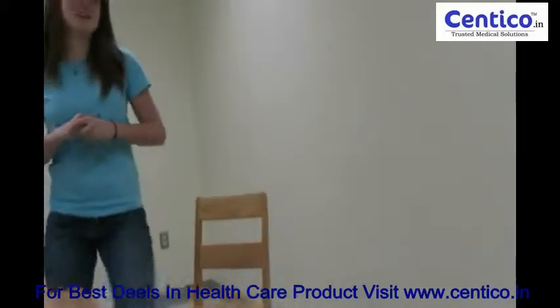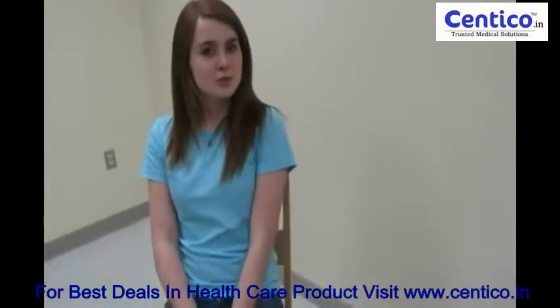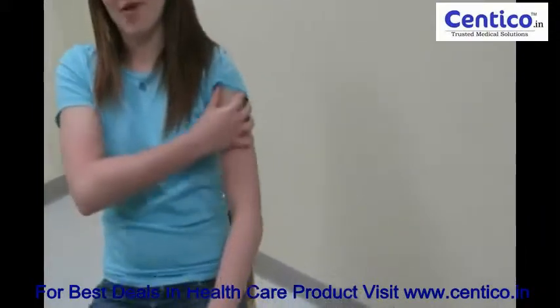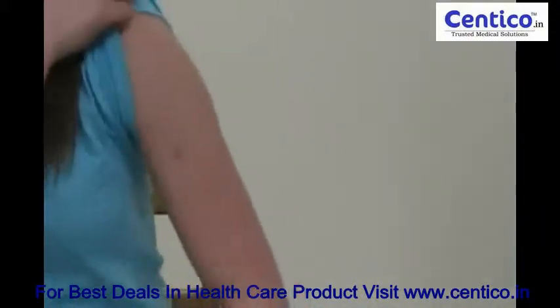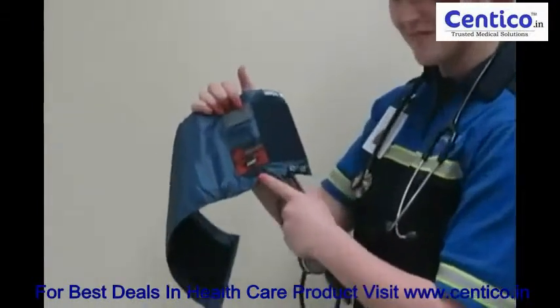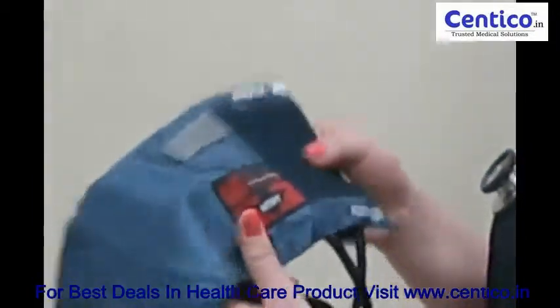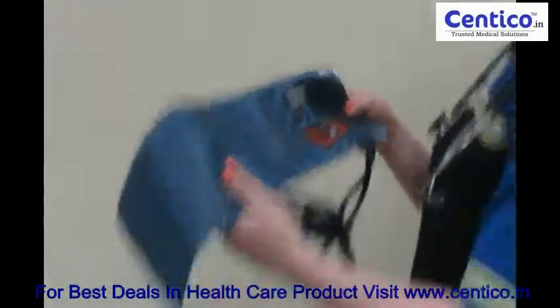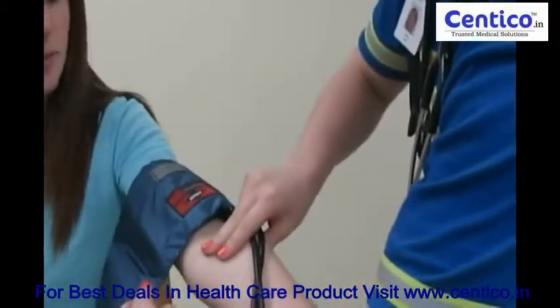First, I need to be sitting or lying down, comfortable and relaxed. For an optimal result, my arm should be free of all clothing, so my shirt needs to be removed or my sleeve pushed up. There is an arrow on the airbag of the sphygmomanometer, and the paramedics need to set it up so it is centered over the brachial artery. So, they feel the skin around the elbow area.